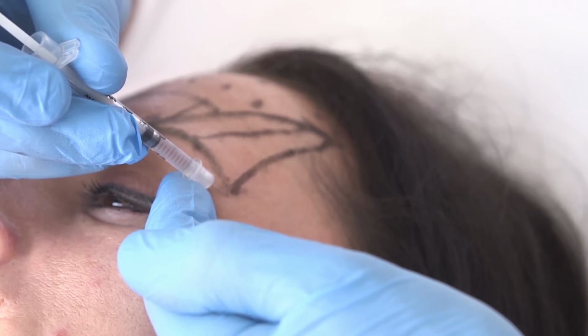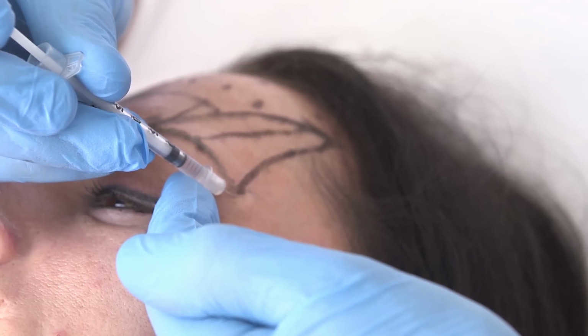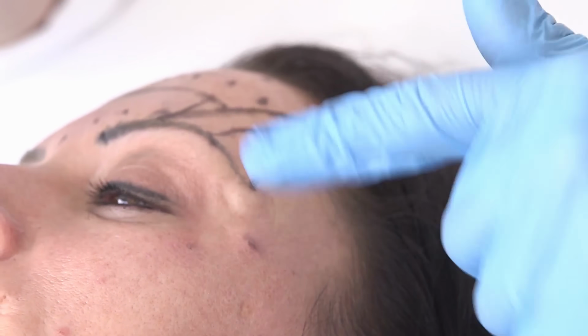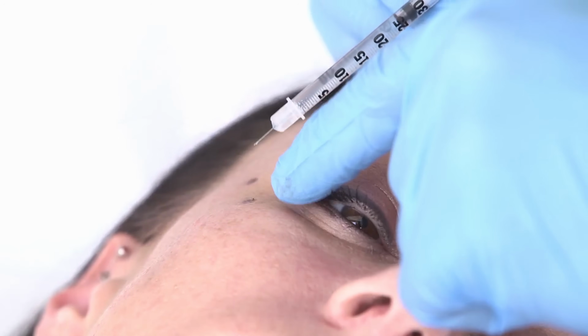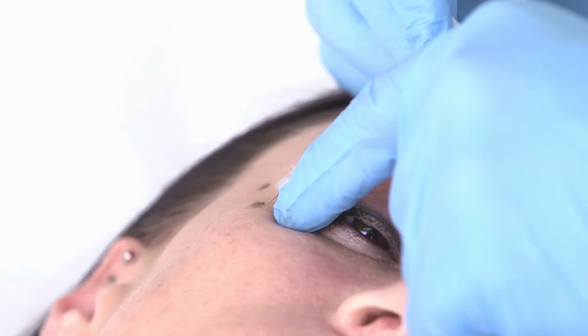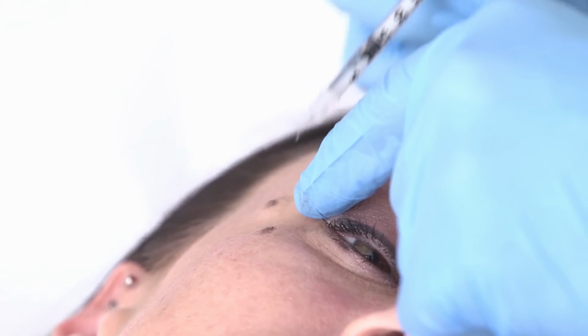A 4-unit injection into the tail of the eyebrow will affect the orbicularis oculi muscle, superior and laterally, and create a little lift, with minimal risk and side effects possible. You can see how we could further increase this lift simply by treating more of the orbicularis oculi muscle, which we can do as we go medially underneath the eyebrow. Typically, a 1-unit dose, always very superficially underneath the lateral third of the eyebrow, will enable more lift while still creating a natural looking result.